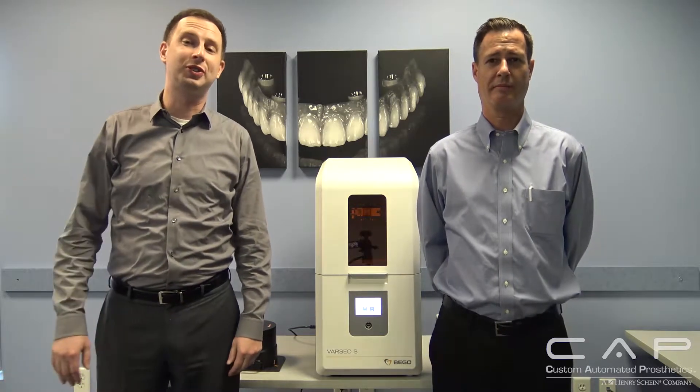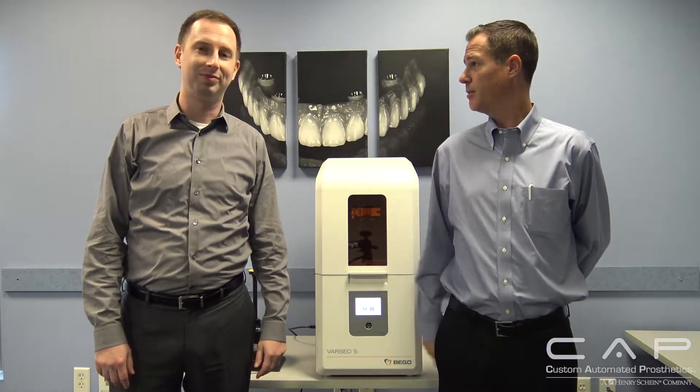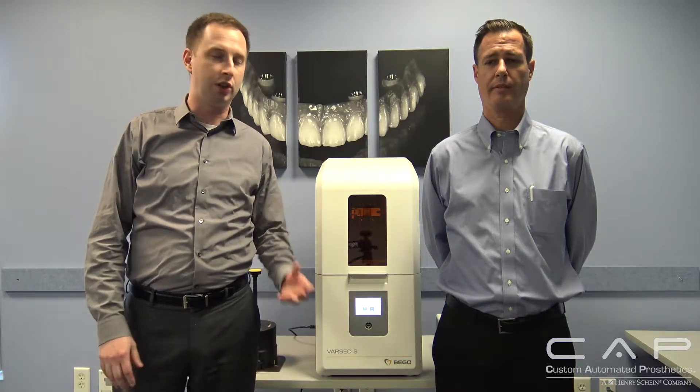Hello and welcome to another edition of What's Going On in the Cap. My name is Sam Wainwright, and I'm Jim Wheeler with Bego. Today we have Bego's new 3D printer, the Bego Varseo S. It's just brand new — we just got our first one here this last week and just got our team trained up on it, and it's really exciting.